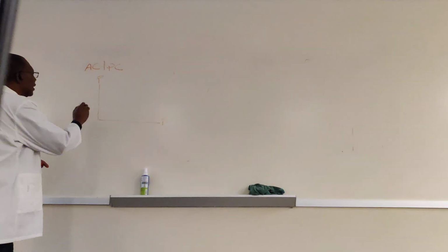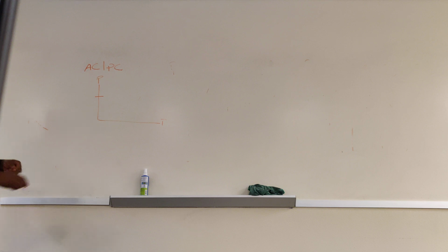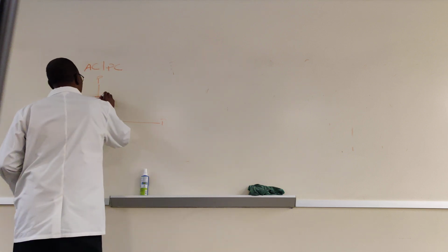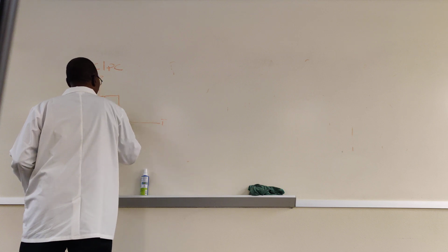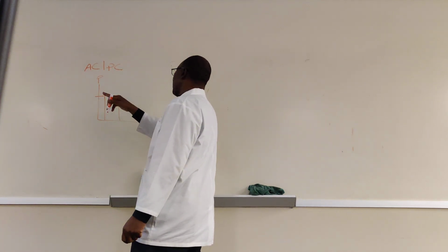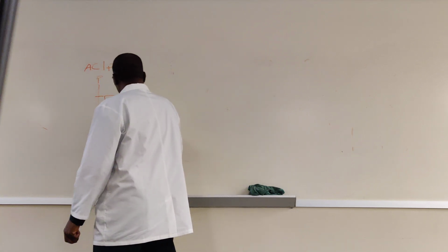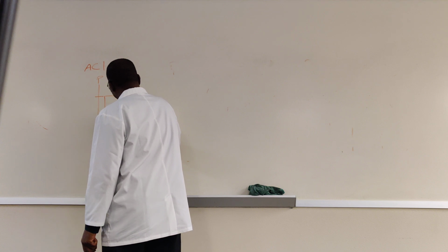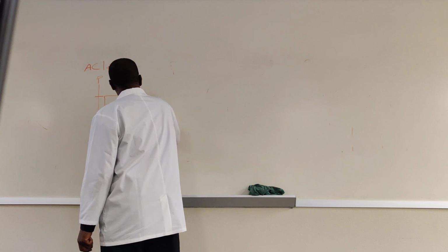But the only difference is that you're always gonna have the pressure rising to the set value. So here, the machine triggered, it goes like that. The pressure has to remain the same throughout the phase of inspiration. That's why we call it pressure control. And then on the next one, the patient triggered, like that.